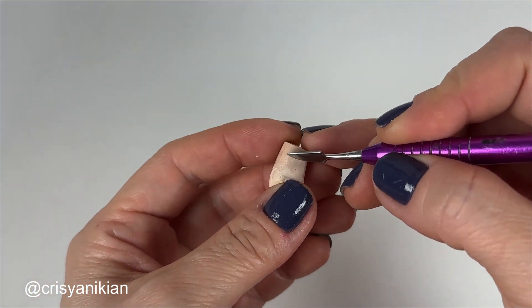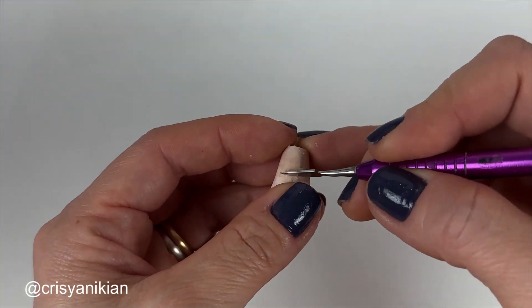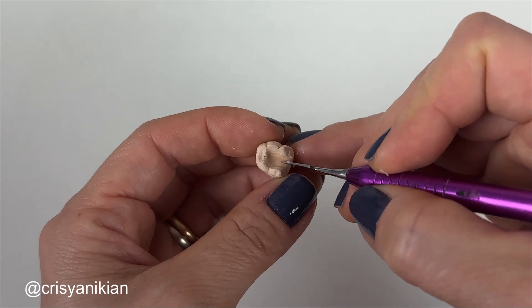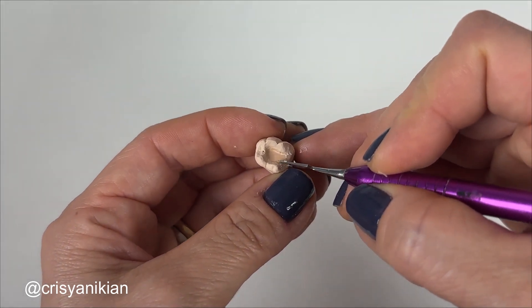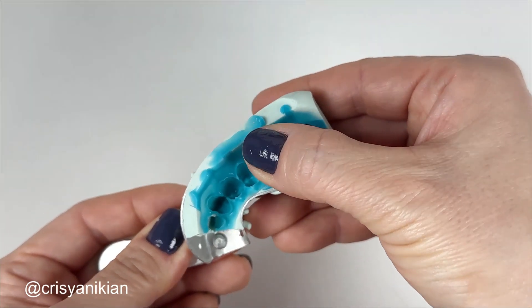Carefully remove wax excess using a Lecron spatula for this purpose. Then fit the die crown into the plaster cast — it should fit well.